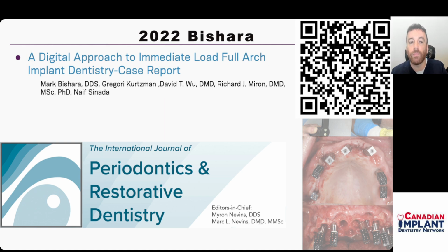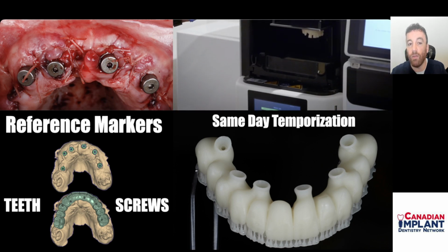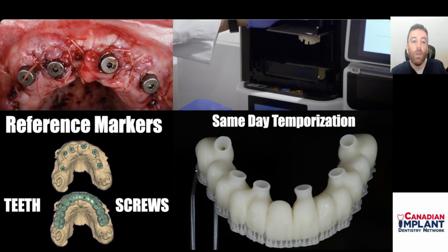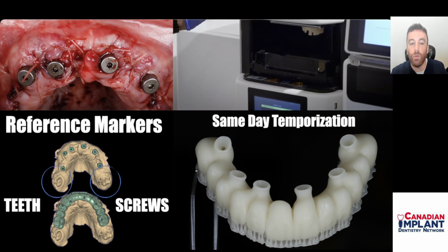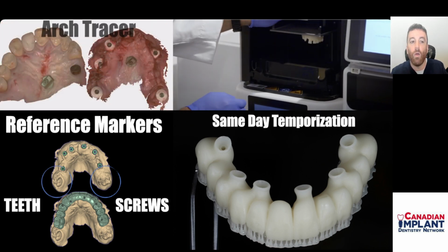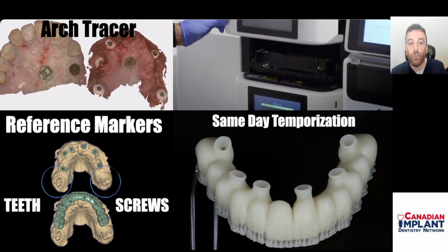Our approaches involve keeping teeth either as reference markers, and those teeth get removed at the end of the surgery, or alternatively, if there are no teeth you can use as reference markers, then we rely on screws. These screws are placed either in the palate or in the chin area of the mandible. As an example here, we're using the arch tracer screws.